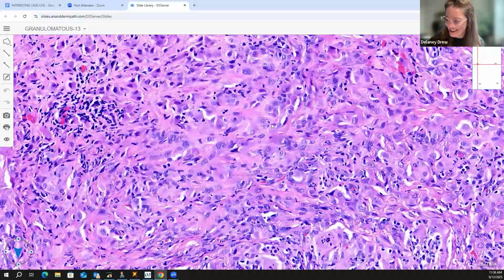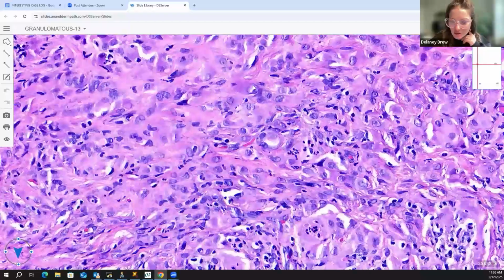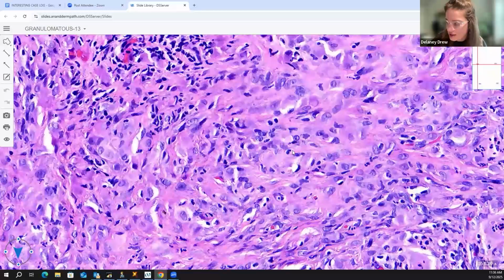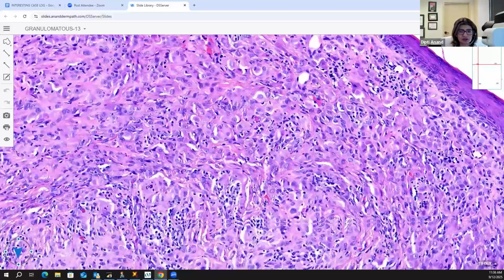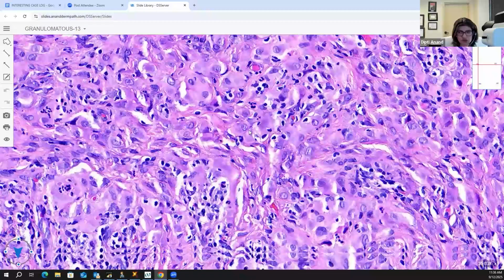I saw some purple histiocytes in punched out lacunae with the two-tone cytoplasm, and then occasionally some bi or multinucleated cells. So I call this the reticulohistiocytoma. Yes. Now, does everybody see the difference between this versus the xanthogranuloma? When you see a reticulohistiocytoma, you will know it. If you're getting confused between a reticulohistiocytoma and a xanthogranuloma, you're dealing with the xanthogranuloma.